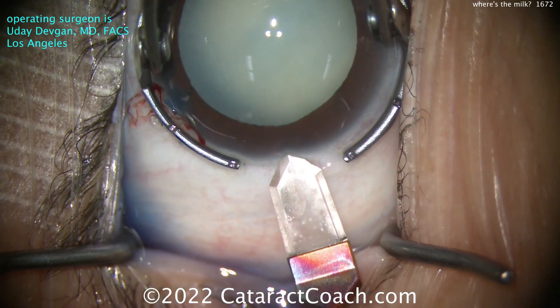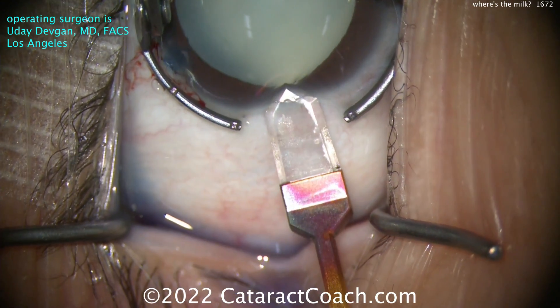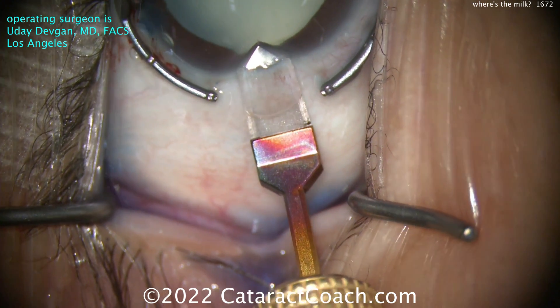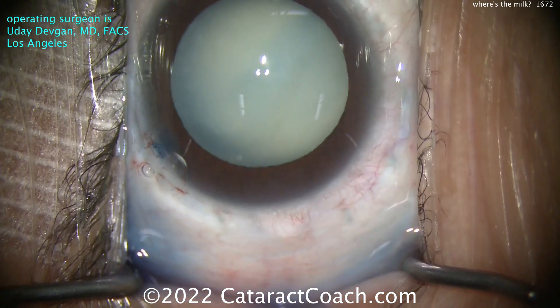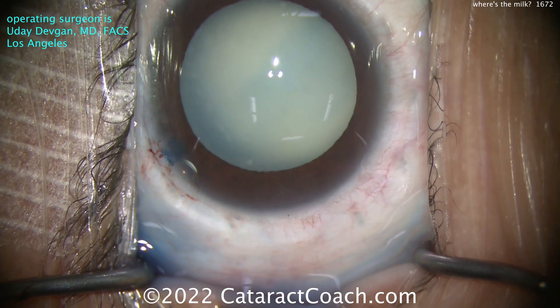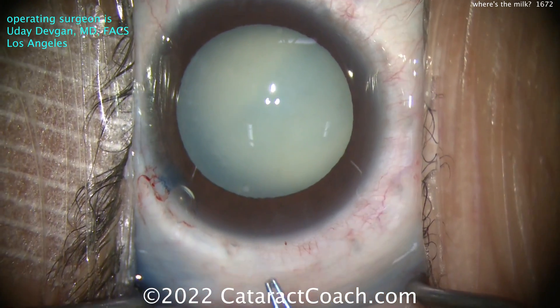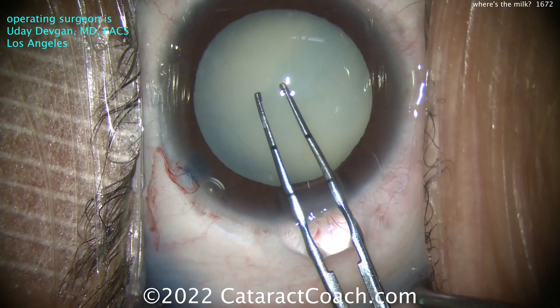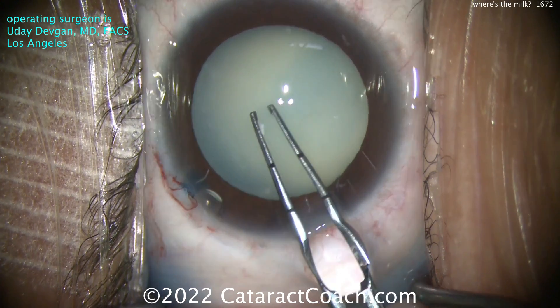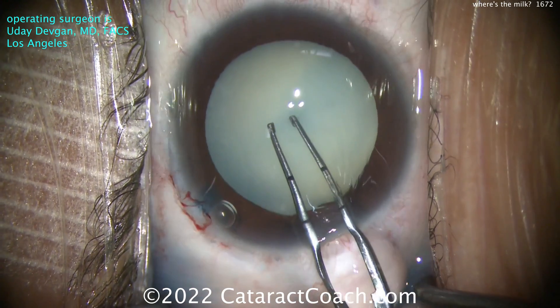Here comes the main incision using a diamond keratome. This is a white cataract that's obviously been there for a long time and the patient is now seeking surgery. When you look here it looks very white, but there's no intumescent fluid. I can see a dark shadow between the center of the nucleus and the pupil margin - it's a little darker there.